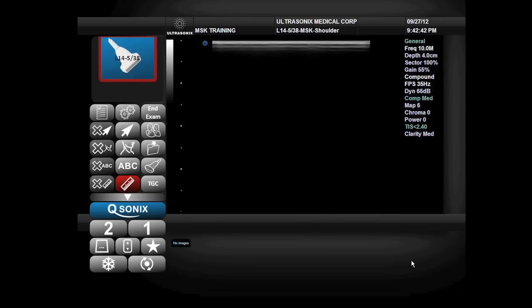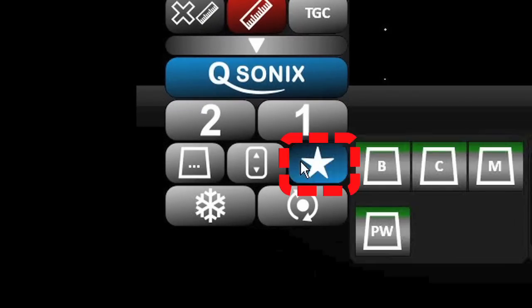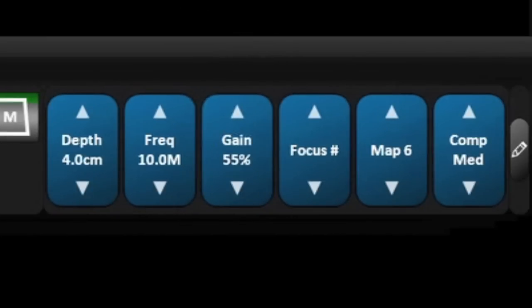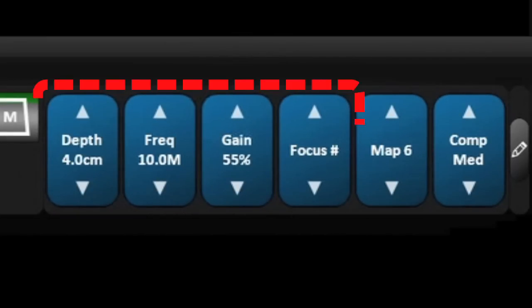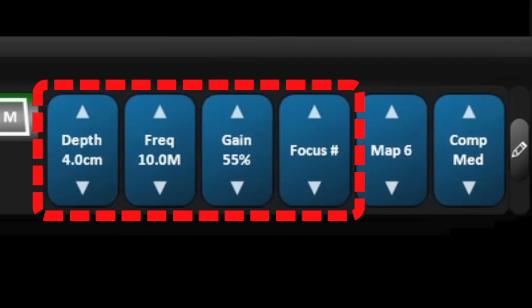Further changes can be made by selecting the favorites drawer, where I can make changes to the depth, the frequency, the overall gain, and the number of focal points.